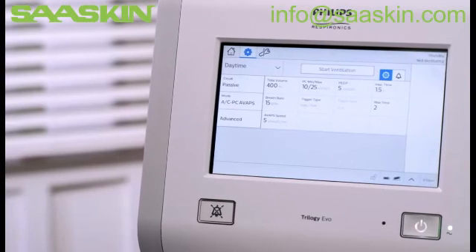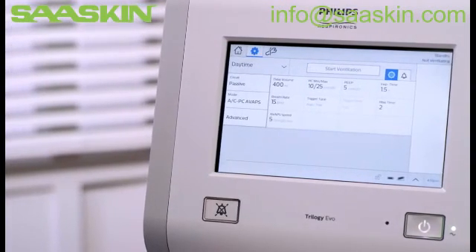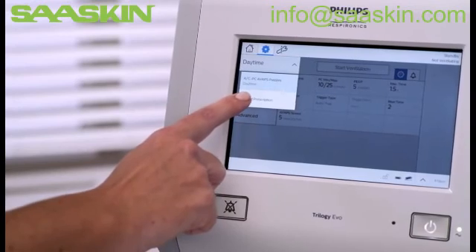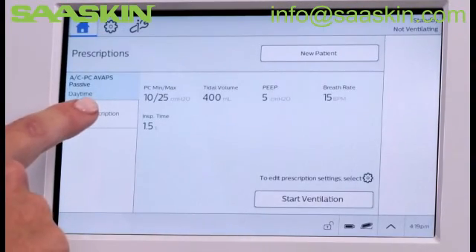Some patients have multiple prescriptions, and Trilogy EVO is able to store up to five. You can add additional prescriptions from the prescription drop-down menu in the Settings window, or go to the Home window when in Standby and tap Add Prescription.